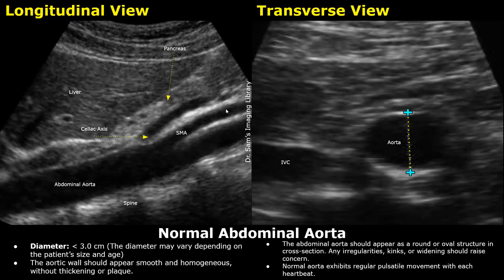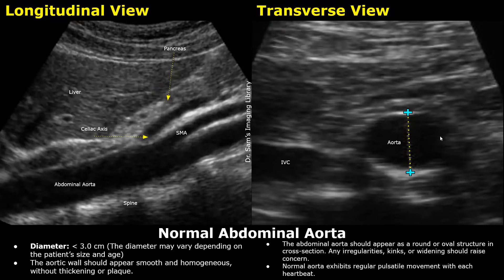This is the liver, the left lobe of the liver, and between the liver and the celiac axis is the pancreas. In this image, the aorta is seen in the transverse plane, next to the inferior vena cava.